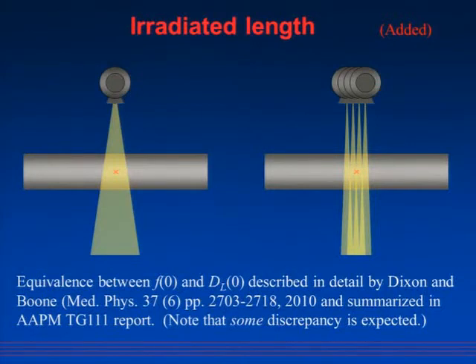The patient dose is actually lower when you have a fixed table and you're using a beam width that's narrower than 10 centimeters. And you're usually going to be using a couple of centimeters in an interventional procedure. So you have a substantially lower dose being delivered to the highest dose portion of the patient than you might think if you were looking at CTDI100.